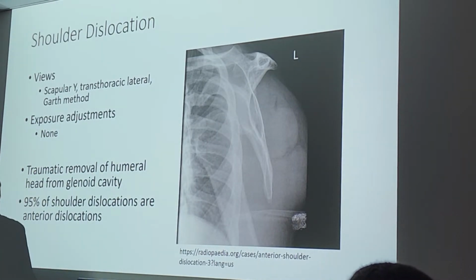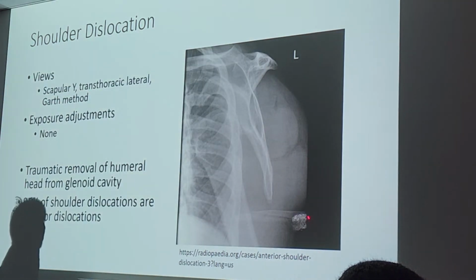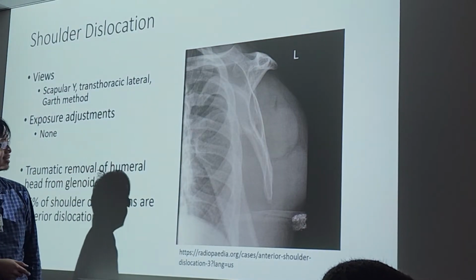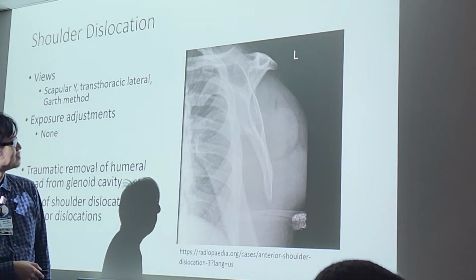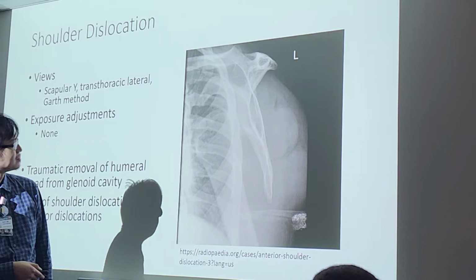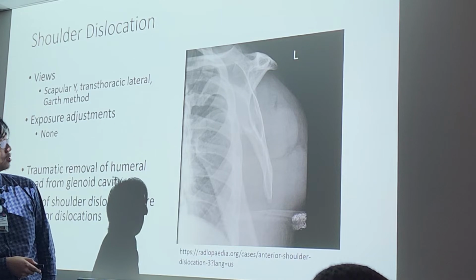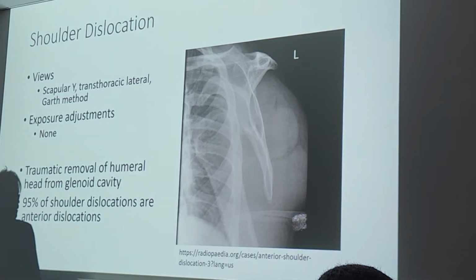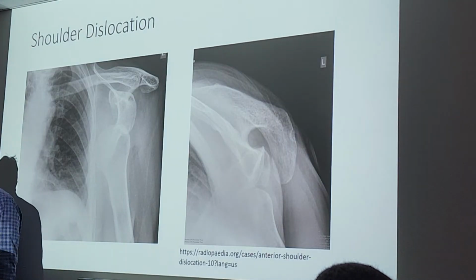Anterior dislocation. Mr. Phung, what was that thing around the patient? That artifact? To the bottom right there, good question. What is that? I don't know. Would it be Velcro? It does look like Velcro. So this potentially could be maybe like a splint or a sling or something like that.